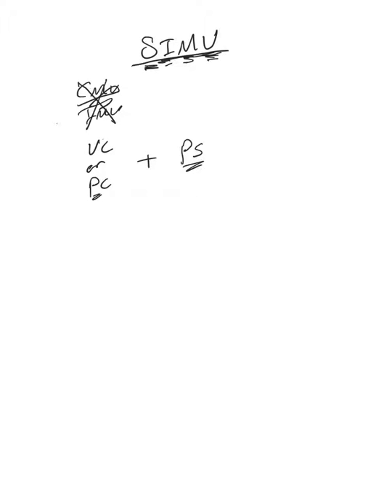So basically here we're telling the ventilator there is a backup rate, let's say 10 breaths per minute. During these 10 breaths per minute, the patient will receive full support from the ventilator, according to whether we're using VC, volume control, or PC. Here we receive the tidal volume that was set for it, and here we receive the target pressure that was set for the inspiratory time that was specified.